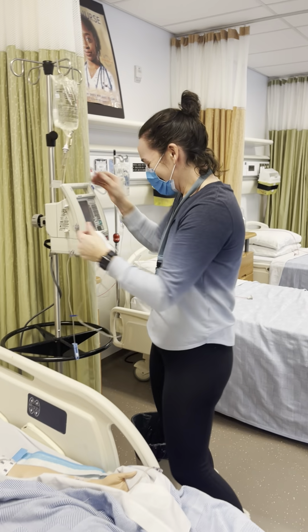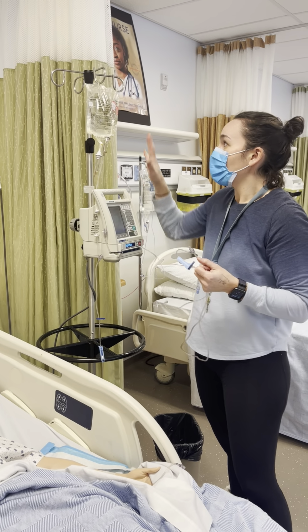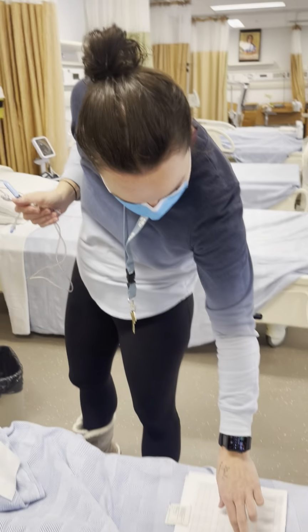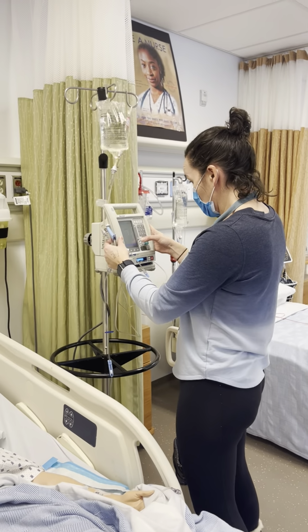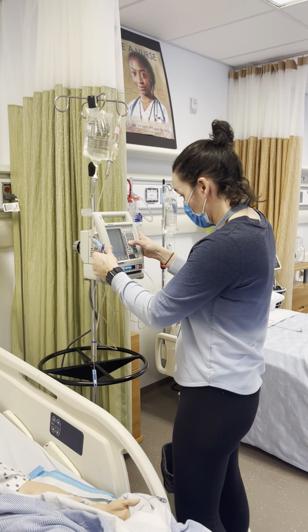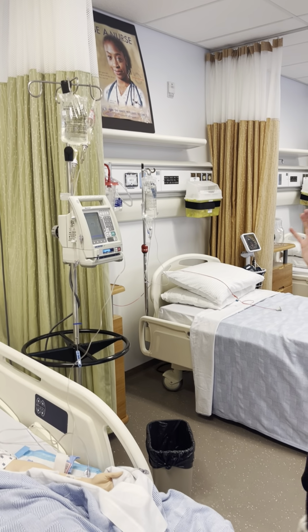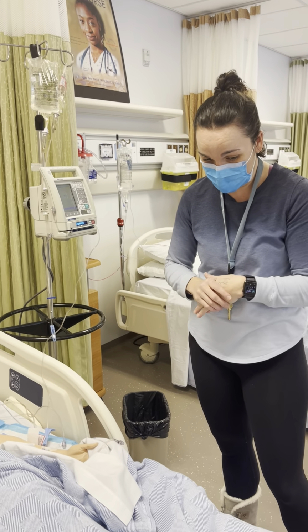Okay. All right. So we've got this loaded. Now we know the concentration of our bag is 0.99 units per milliliter, and we want to run it at 2 units per hour. So we're going to go 2 milliliters per hour, our volume is 101. And so that's good. Now at this point, we could get a second nurse to come in and she would double check the patient identifiers along with the rate, and she says everything's okay.